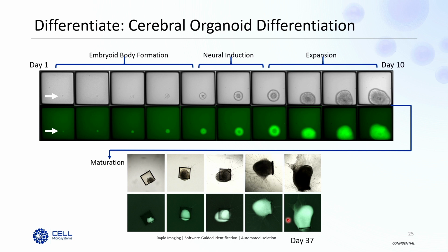So it's not as much of a formed layer as you might be used to with domes or layers of Matrigel. It's much more of a looser matrix, but you can still pretty easily do media changes from the array without disturbing the organoid location. So with these iPSC differentiation protocols, they require full media changes for each of these processes. For your adult stem cell derived organoids, usually I just recommend to our customers to do more frequent half changes, just so they're not potentially risking the disturbance of the organoid matrix layer.